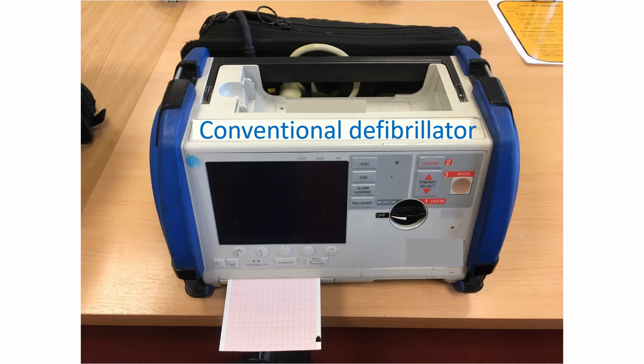The most important precaution during the use of a defibrillator is to keep out of contact with the victim, or else you may receive a shock. This may occur even if there is water connecting you and the victim. So, an all clear announcement is commonly used by the operator prior to delivering the shock.